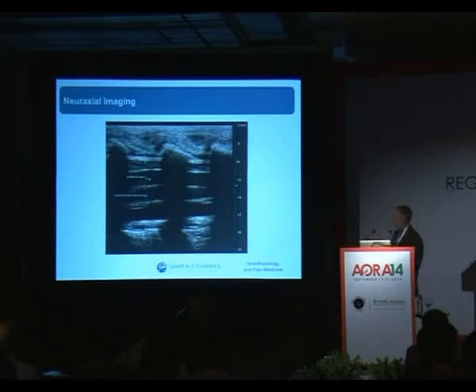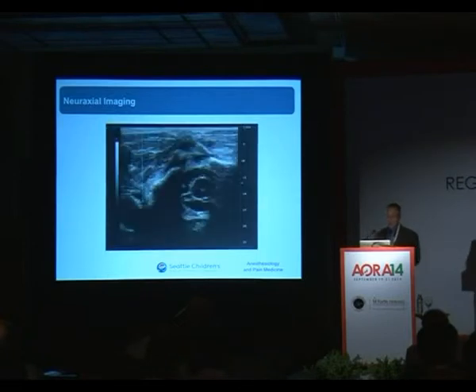This is an image of the neuraxis of a neonate. The depths you can see here, 8 millimeters down to 2 centimeters. The epidural space, 1.5 millimeters in width, is beautifully demonstrated with this high-frequency micro-ultrasound. And another image of the neuraxis prior to placement of a paravertebral block in an infant. Again, the depth, to orient you, 2 centimeters.